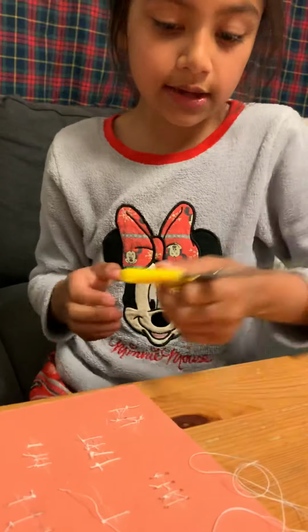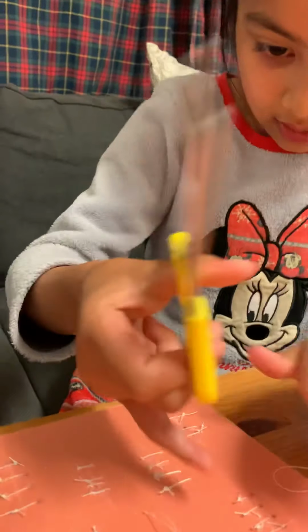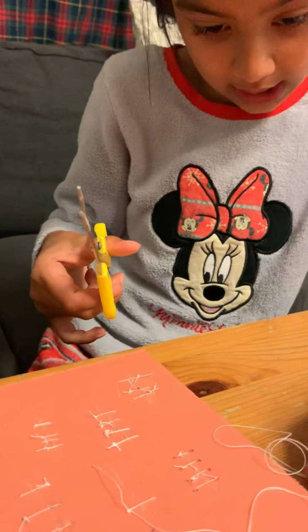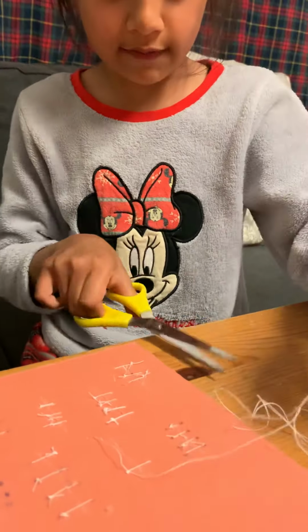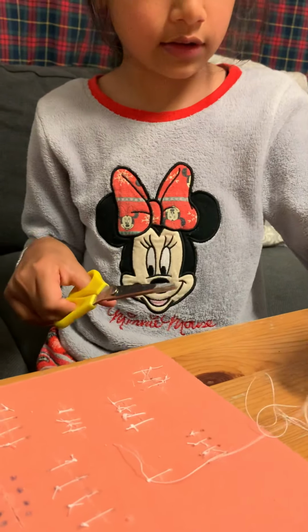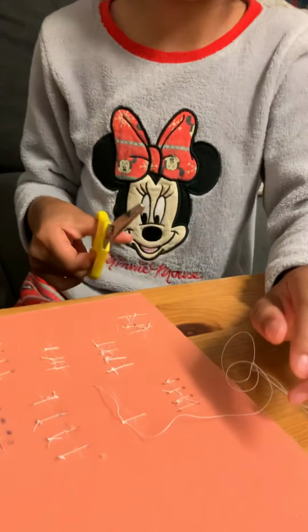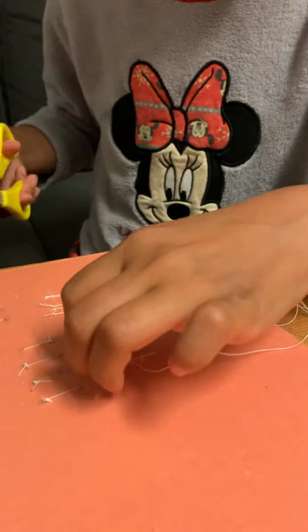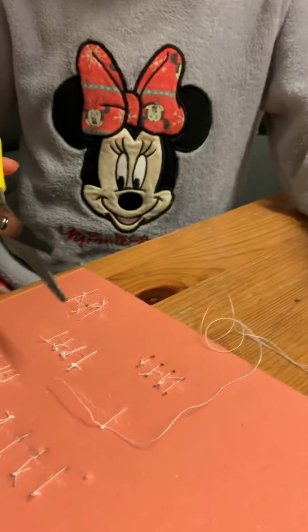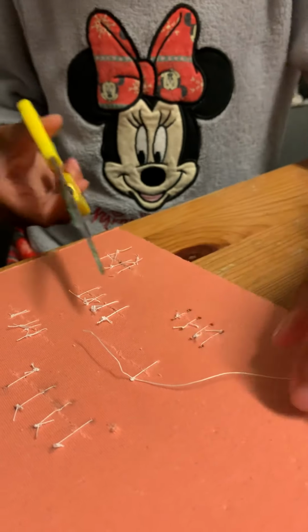So now, to keep things clean, and things aren't getting messy with this thread here, you can be careful with this needle. If you have a table next to you, you could just put the needle on there because you don't want anything affecting the skin or anything like that. So you could snip off the excess and remove the needle and the excess thread.